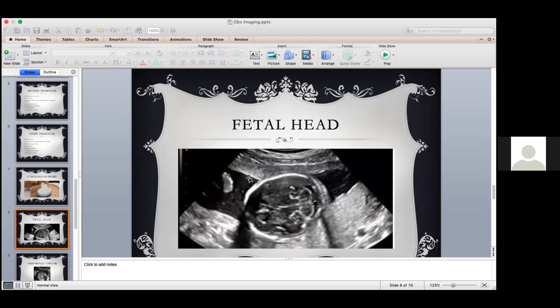Okay, so this is the fetal head. When you're taking the biparietal diameter, we want to take it from the outer aspect of this bone to the inner aspect. Unfortunately, I don't have the nice inner aspect, but the inner aspect on the contralateral side, cutting through the thalamus. This is the level of the thalamus of the fetal brain. So we assess the structures. When you're looking at it, we want to see that the falx is present, and this is the cerebellum right behind here. These are our choroid plexuses, these two white things here. Okay, and then a bit of the ventricles is seen here.